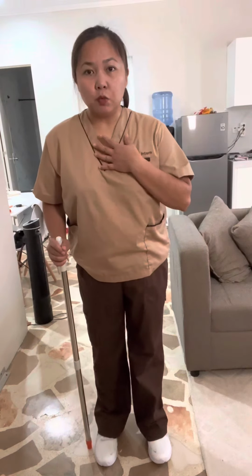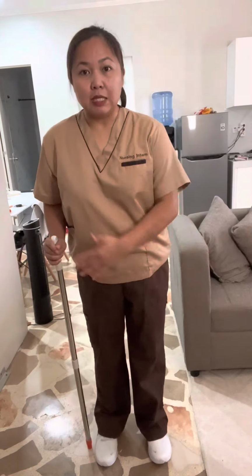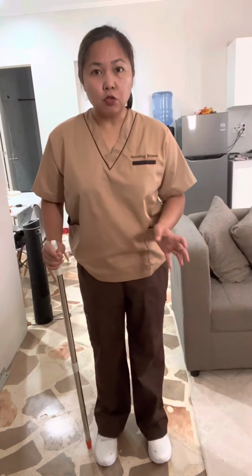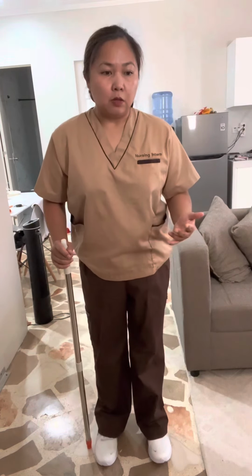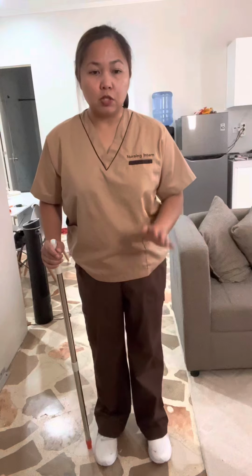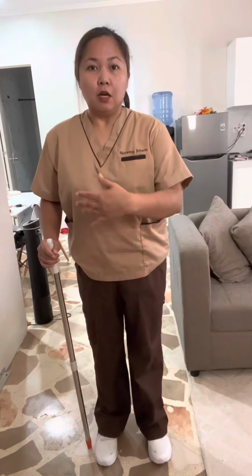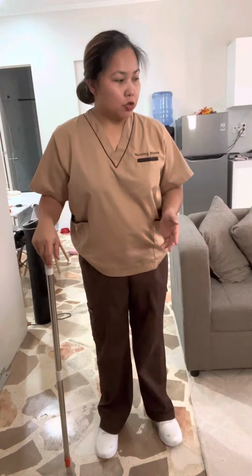And as a nurse, you would like to stand behind them or a little bit closer to them. That way, just in case they may fall or lose their balance, you're there to support them, even before there's a potential for a fall. So just assist them, be on their side once they start to ambulate, and continue to ambulate until you reach your desired destination with the patient.